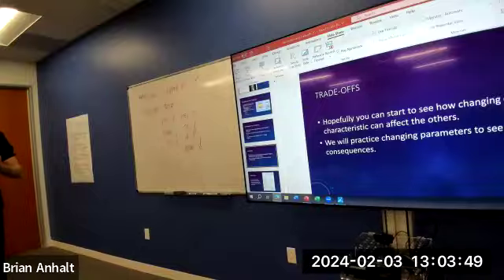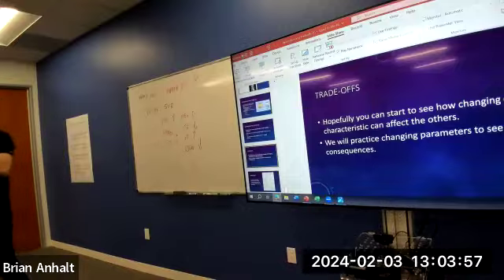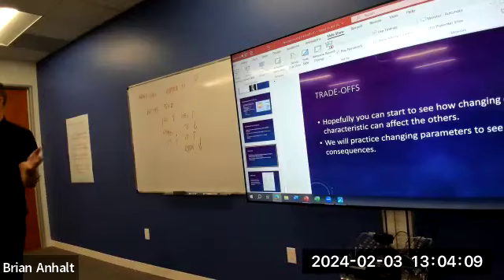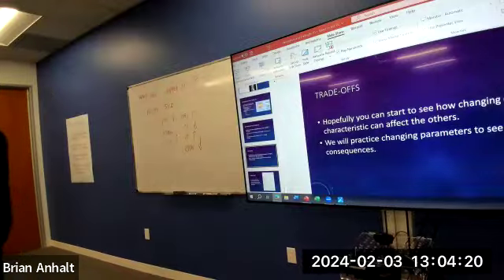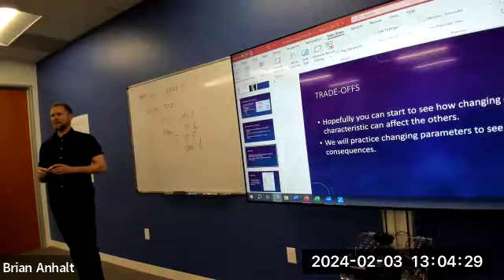So it does take experience. Your scanner is going to determine how the protocol is built to begin with. Typically the protocols that come out of the factory are overbuilt. They have so much SNR in them. They have so much resolution. You can cut things down and make changes to get it faster. They build them so you can just run it and it's good. But typically they're too long because they're overbuilt, right? That's why you have an app specialist come in and make corrections and make it fit your needs. I've seen protocols where I was able to almost halve the scan time and it still looked fine, still looked great.